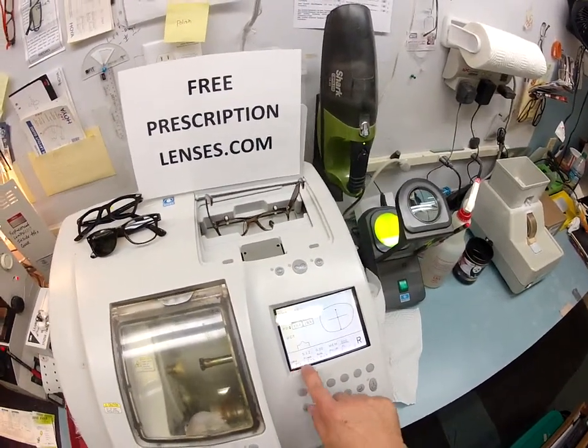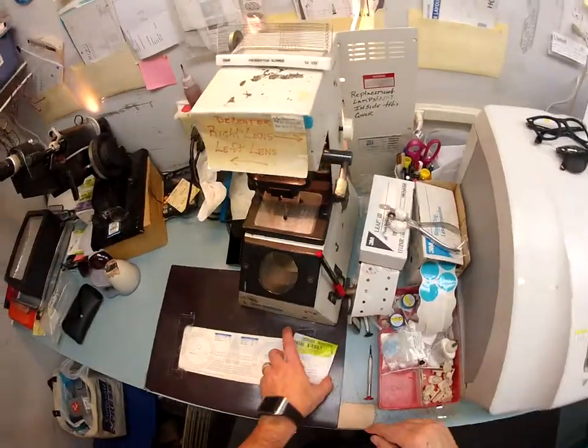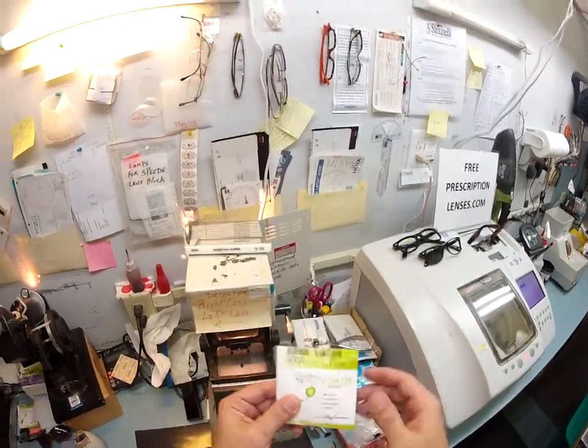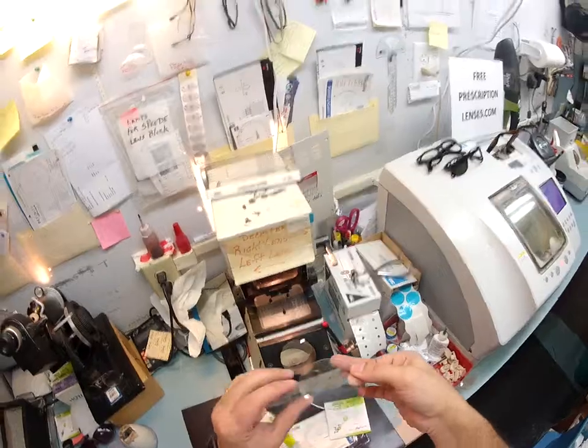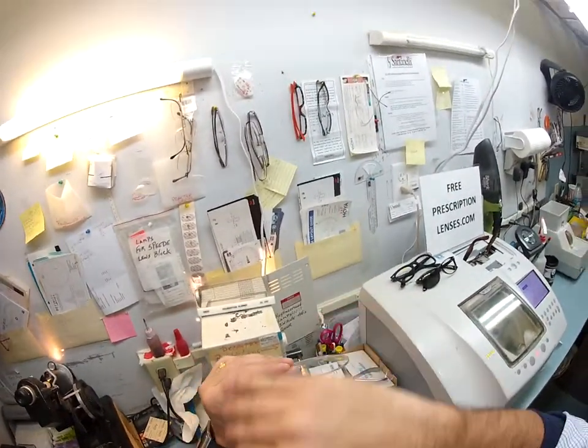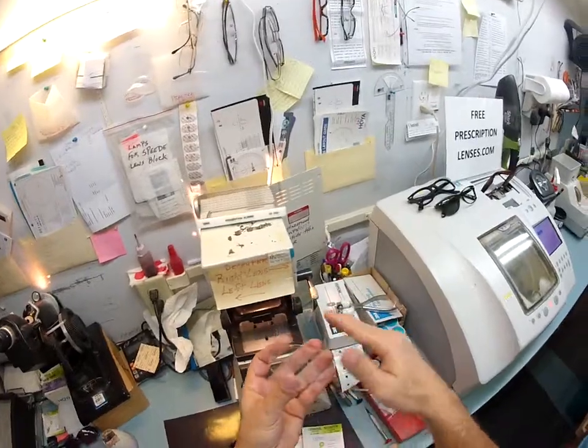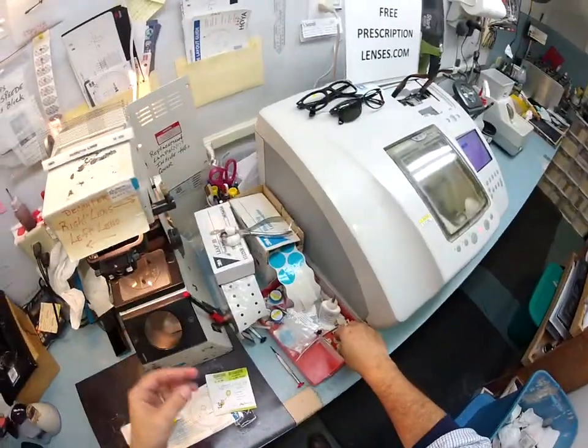This is a polycarbonate lens being cut for a zyl frame, which is an old school name for plastic. Here are your lenses — a lighten-up, fast tint, aspheric lens, meaning it's not spherical. It doesn't have that round bulging fishbowl look. This is a flatter lens. The curvature is much flatter, giving you much better cosmetics.